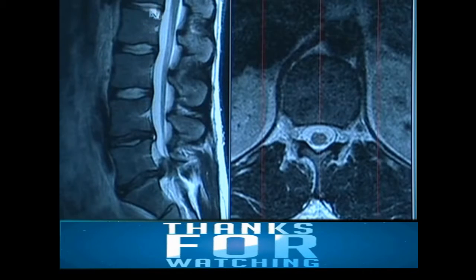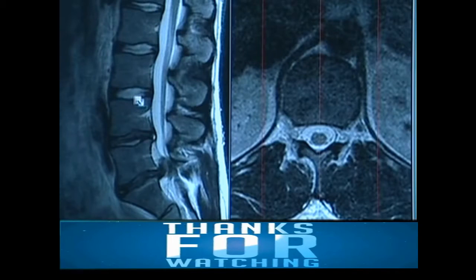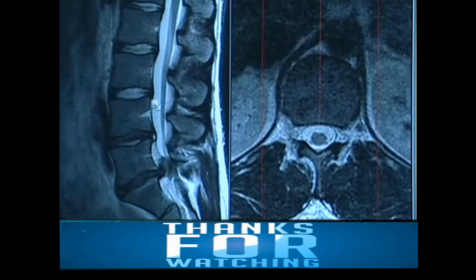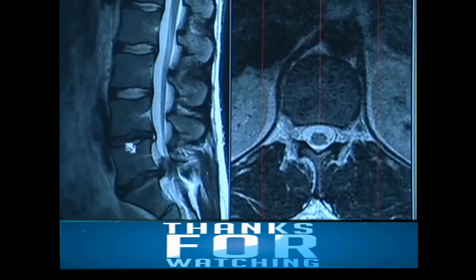The L1-2, L2-3, and L3-4 discs are normal. The white on the inside is the jelly, full of water, and the dark plies of the tire — normal here at those levels.